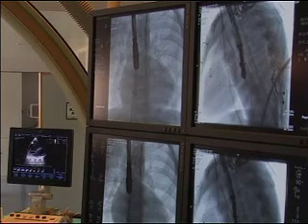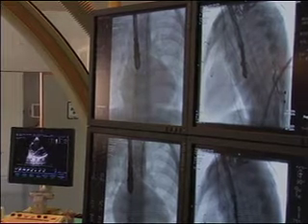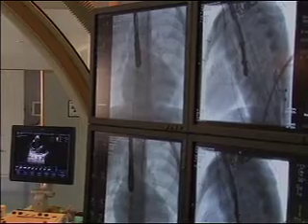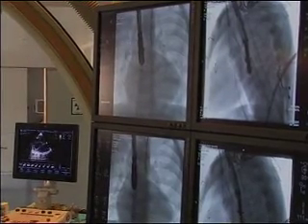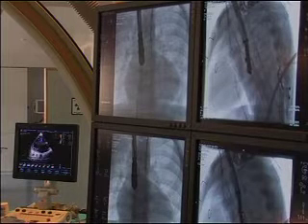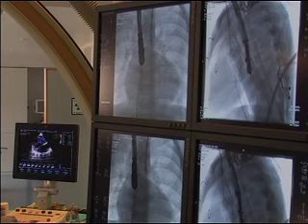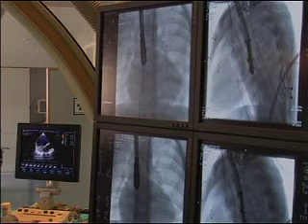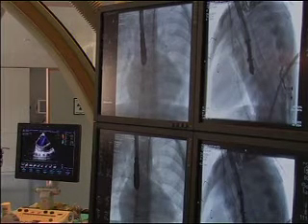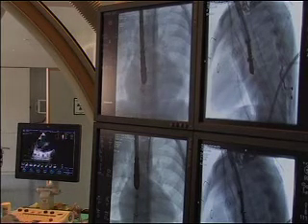So I retrieve the needle and I will try to aspirate it. Déjame una jeringa. ¿Es un clot o es de Eustachian? Es un clot. No, I think it's a clot. I will remove the introducer and I will begin once again because I think this is a clot. Don't you agree?